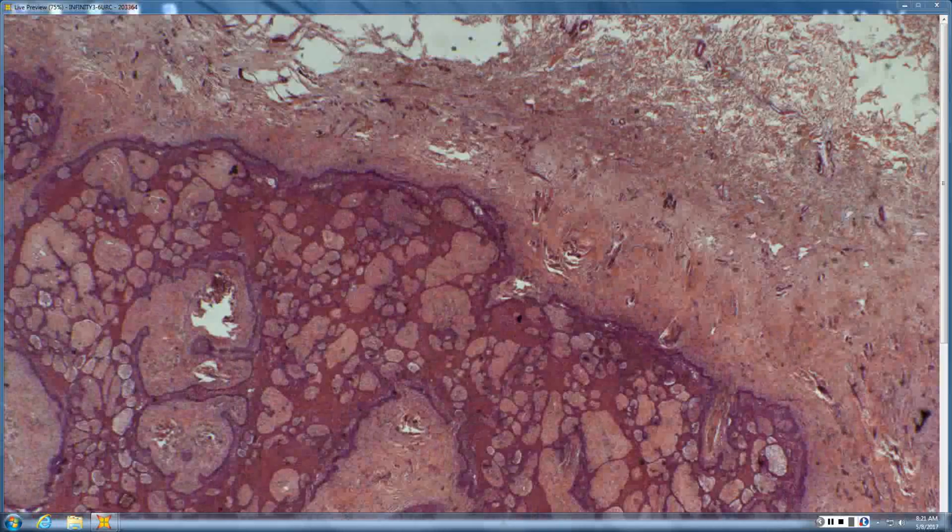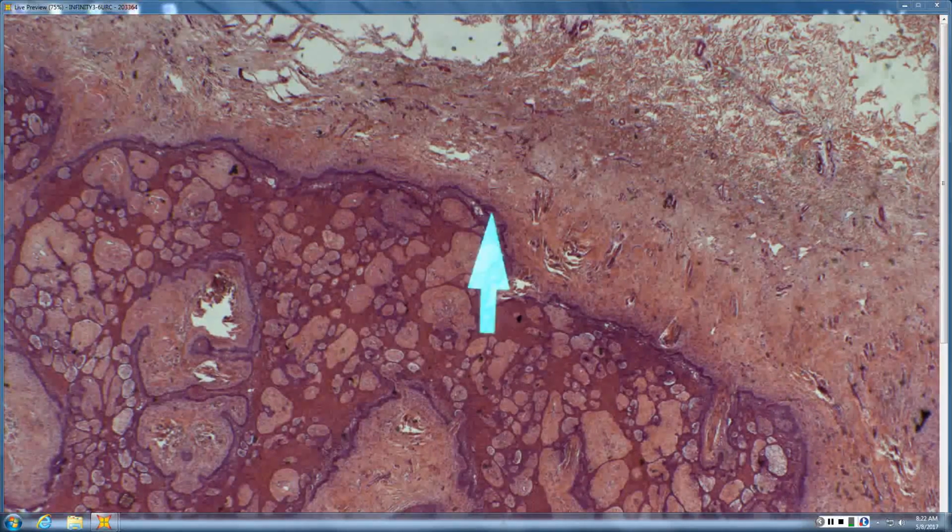So like a lot of pink strands, it looks like. Pink strands, and at the end of those pink strands, blue. So anastomosing pink strands, blue buds. Pinkus tumor. Well done, sir. You get to hit the easy button.